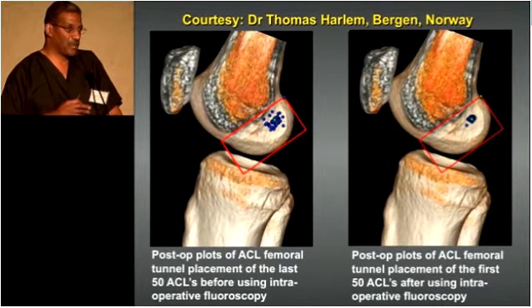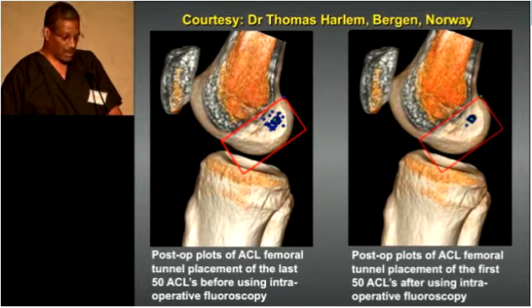So I use it on pretty much every case. It takes at most 5 minutes to the case, and I think it can help you become a better surgeon. Particularly if you're training doctors and residents and fellows, I think this is a very useful tool to help improve the consistency of the tunnel placement. So that's basically what I wanted to say, and any questions?